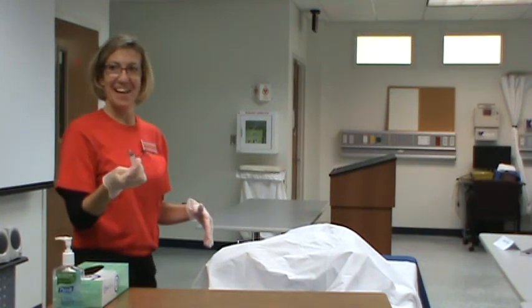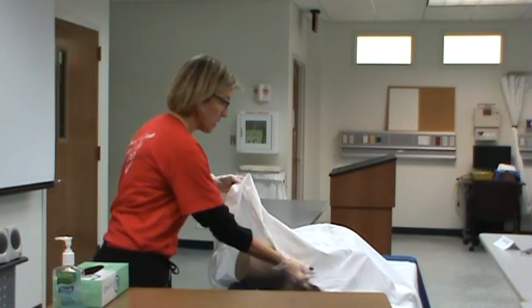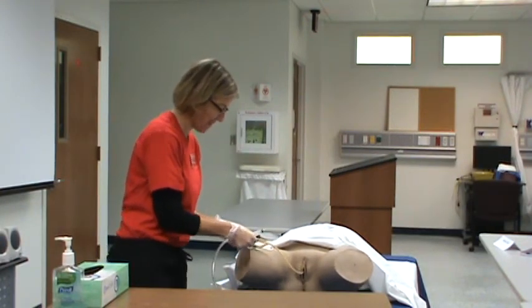Okay, and that's what I did. I came into the room with my syringe and I opened it up and now I have it and I'm ready. So I tell Mrs. Smith, I'm gonna take your catheter out. The first thing you do is take off the adhesive tape that you broke.